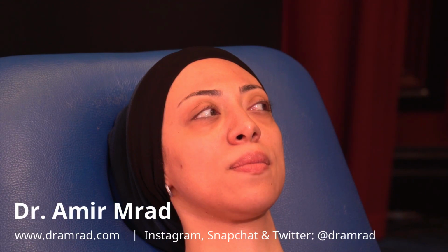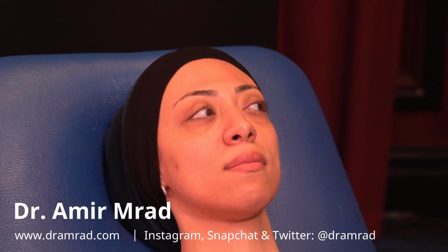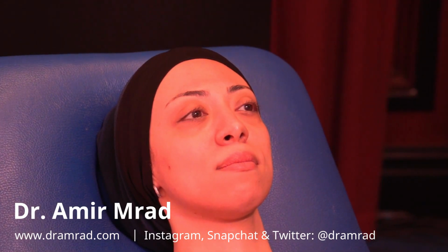It's tricky with our model today, Hiba, to treat the nasolabial folds because of the protrusion of the upper and lower lip. She has a maxillary protrusion, and that might be a little bit tricky. It's difficult to see it on the camera and also on the photos that I've seen for the patient preoperatively. So you need to be careful and maybe minimize the product in that area just to camouflage the upper half of the nasolabial fold.